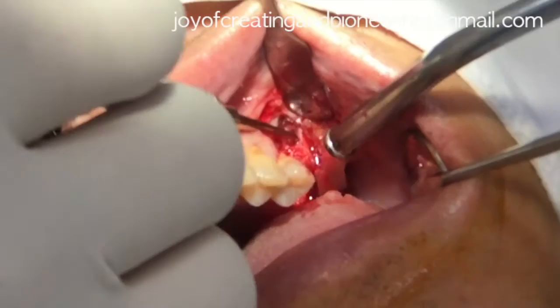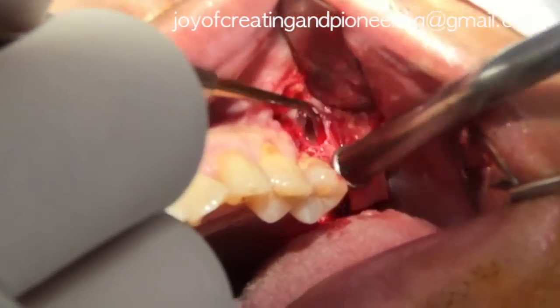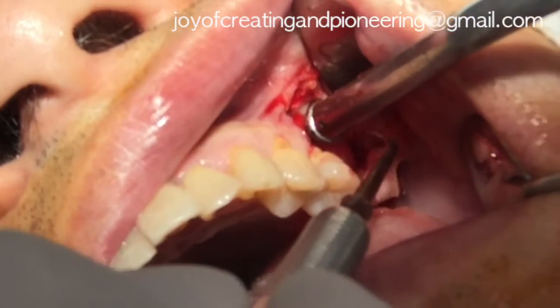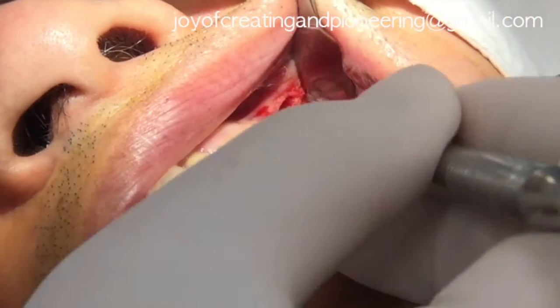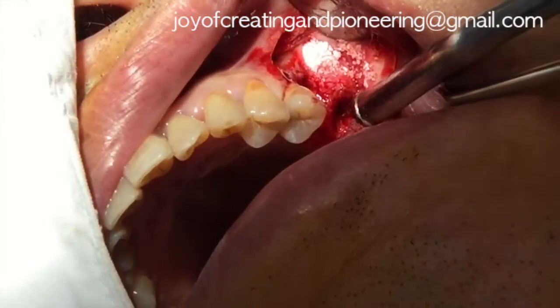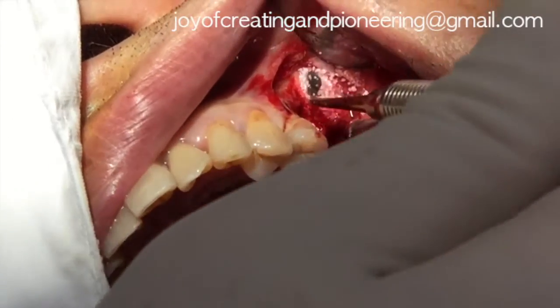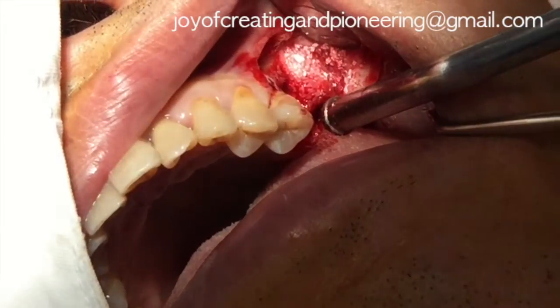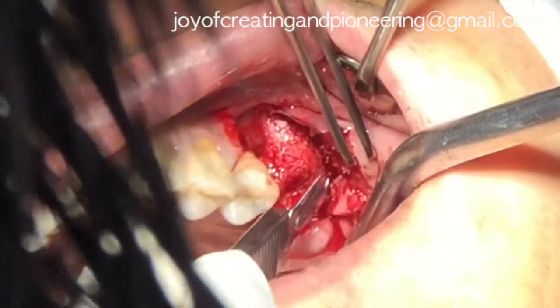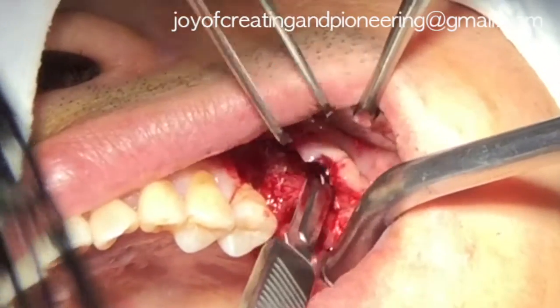It is usually convenient to graft the distal area first, then the medial side. Periosteo-releasing incision was placed for the tension-free primary closure.